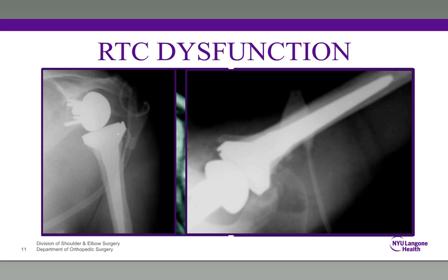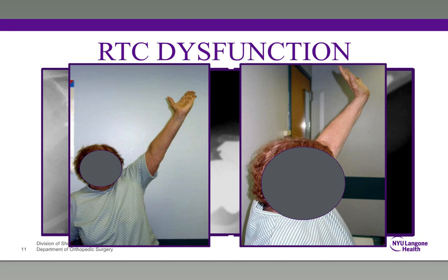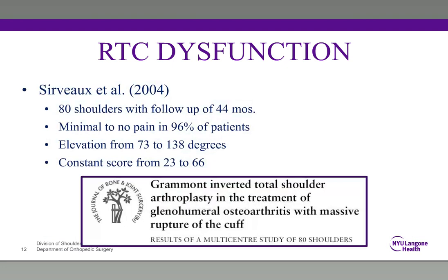Once again, the Delta 3 design. The patient then came back to see me about 10 days after surgery, essentially to have the sutures removed. She has not officially started her supervised therapy yet. She comes in, I ask her, so how are you doing? And she says, I'm doing fine, and raises her arm like this. And this is when I was convinced that reverse replacement clearly does work and that I'm going to be using the prosthesis a lot more frequently.